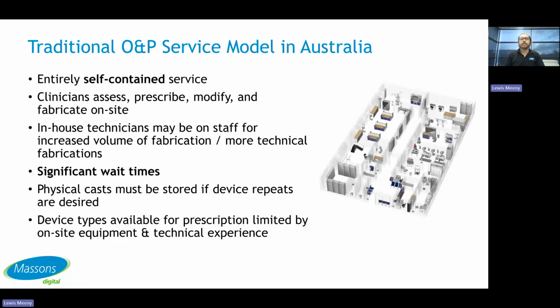And the different devices that you can actually prescribe can be limited by what you have on site to fabricate with, as well as the technical experience of either yourselves as the clinicians using stuff that you might not be familiar with, or technicians using certain components or materials.